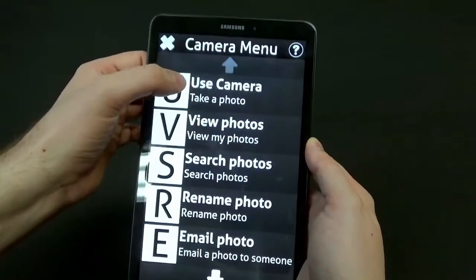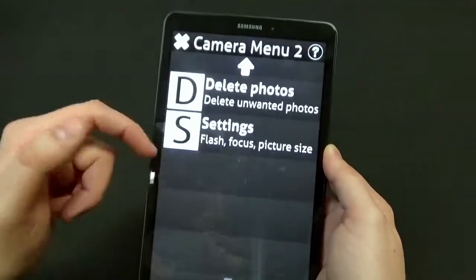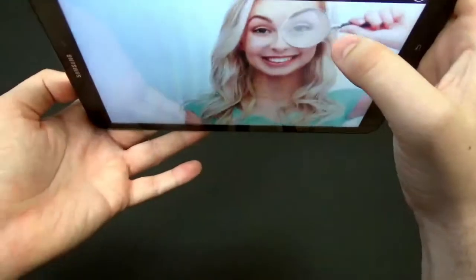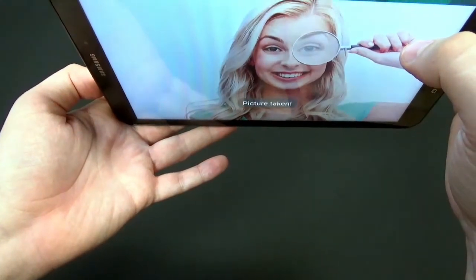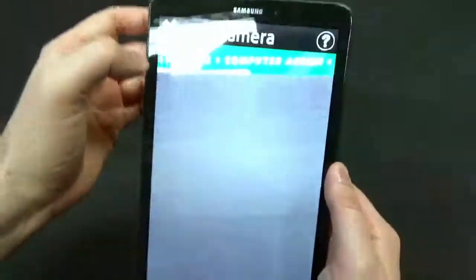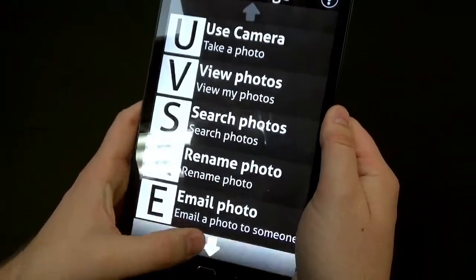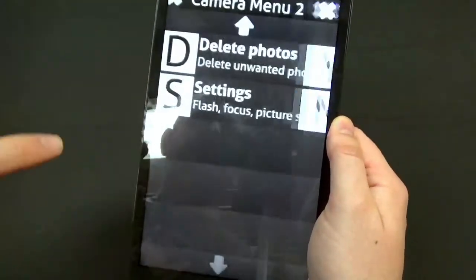Let's take a picture with the camera. Using the camera, you can view your photos, search through photos, rename or edit photos, email them, or delete photos. I'll point the camera up here and take a picture — there we go, it tells us the picture was taken. Going to view photos, there's the photo I just took. I can look through my other photos too. I don't need this photo anymore, so we'll delete it and press okay.